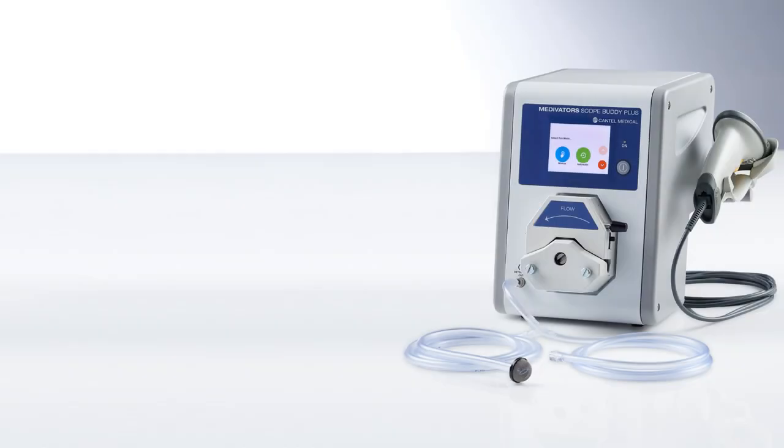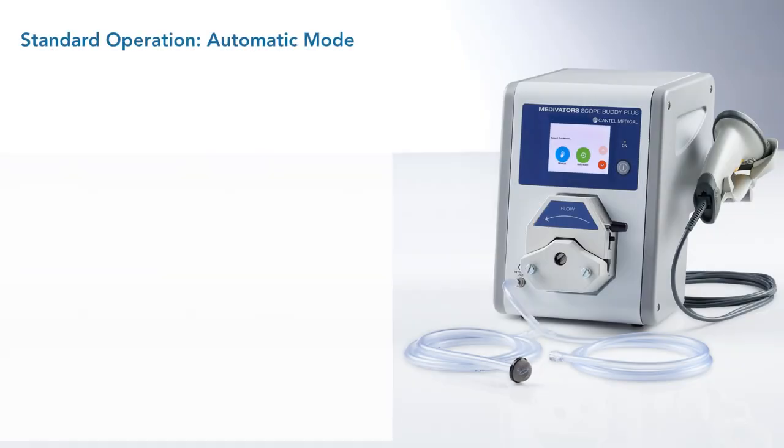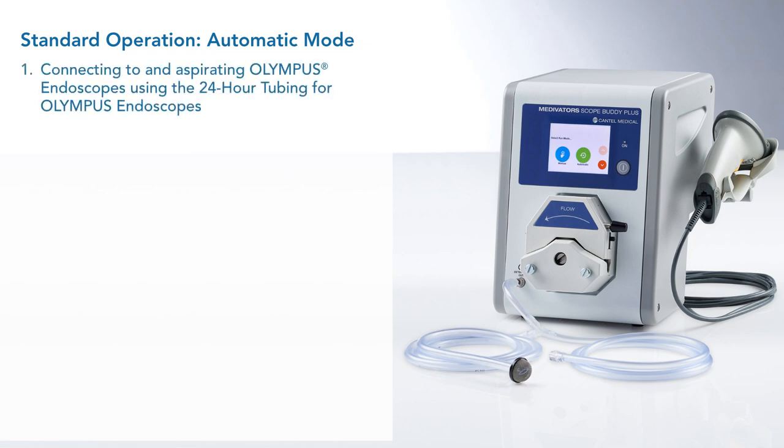This segment of the video discusses the standard operation of automatic mode for your Scope Buddy Plus Flushing Aid. It is divided into seven sections for easy review. The first section will walk you through the entire process using the 24-hour tubing for Olympus endoscopes, pulling fluids from clean containers.